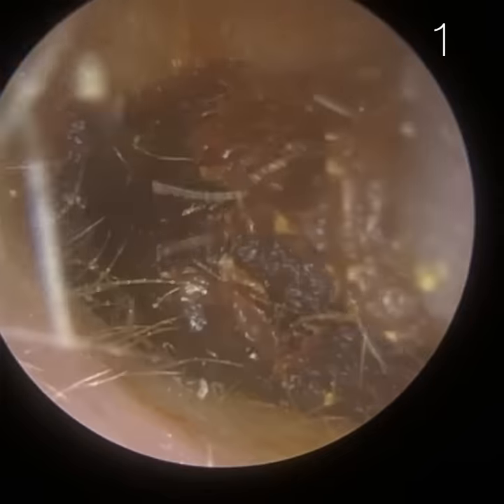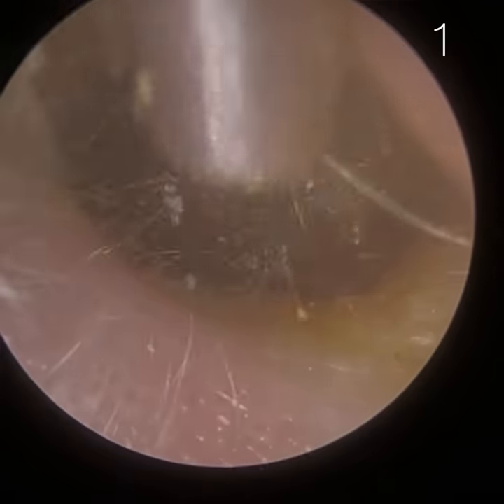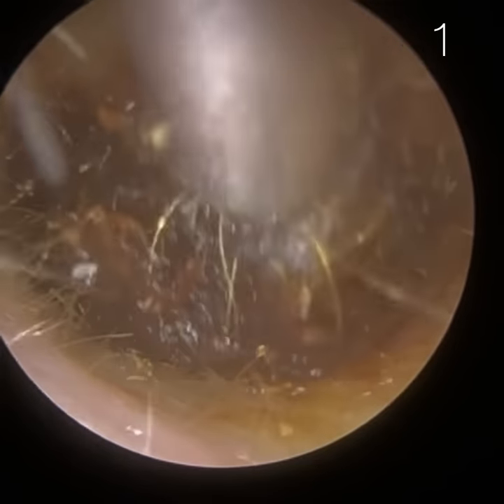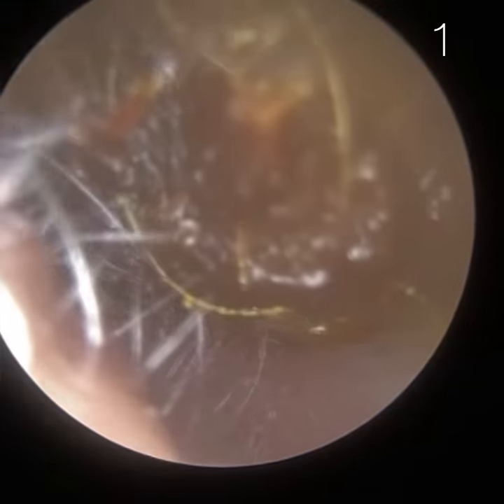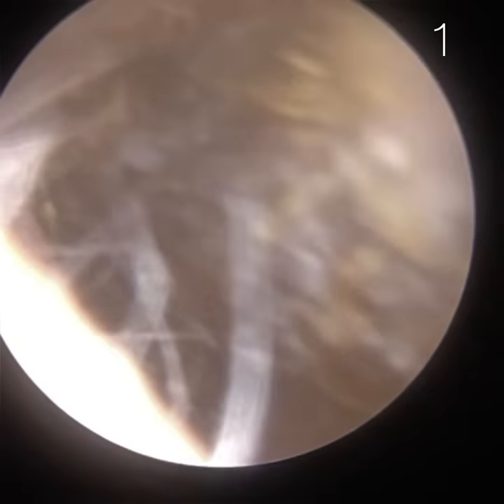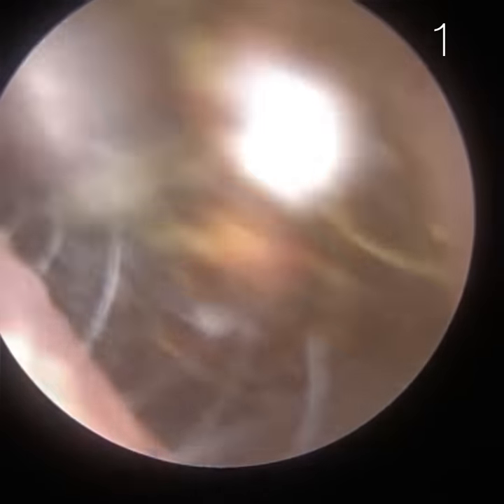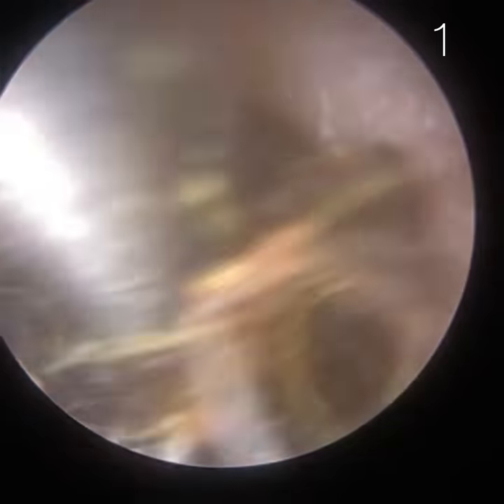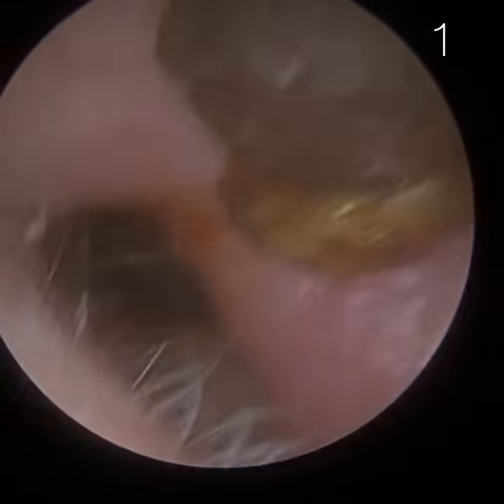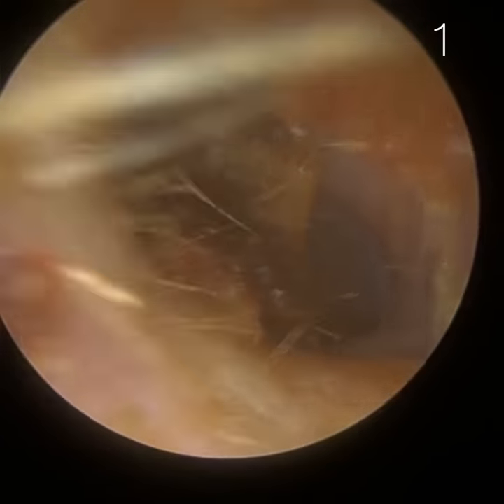I think there is one challenging one thrown in the mix. So this is patient one, ear one. As you can see, their left ear is completely black. They've got this soft consistency of earwax — it's quite dark, so it's potentially been there for a while; it's oxidized. Their right ear was completely clear, so it's just their left side. I'm just slowly but surely teasing this out of the ear. There's a few hairs matted within this plug of wax and a bit of skin enveloped around the circumference of it.